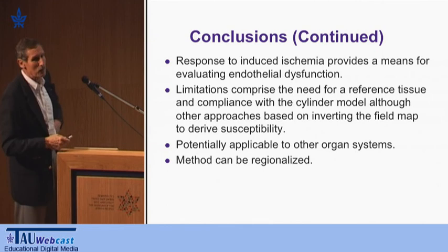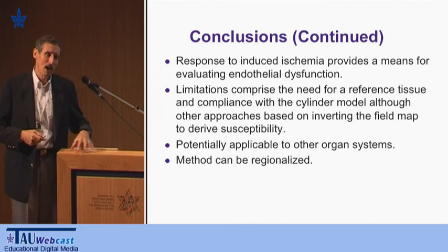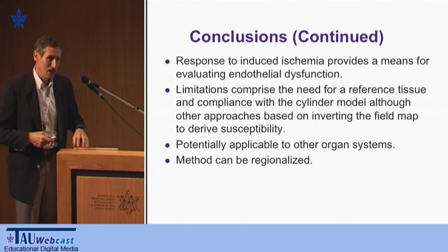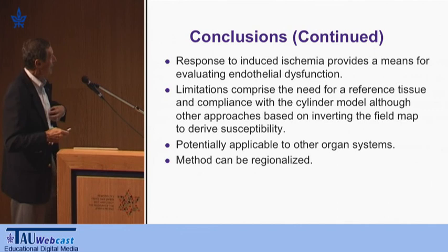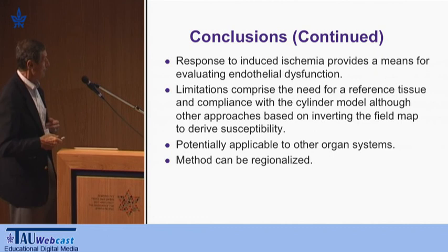And there has to be some compliance with the cylinder model, even though other approaches are possible, such as solving the inverse problem, in other words, doing field mapping and computing the susceptibility inside the vessels. And we know that these inverse problems are inherently ill-posed. We haven't done that yet, but we are considering doing it. It's potentially applicable to other organ systems, perhaps the kidneys. And it's also possible to regionalize the method.